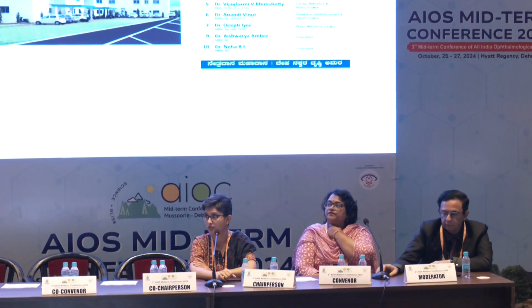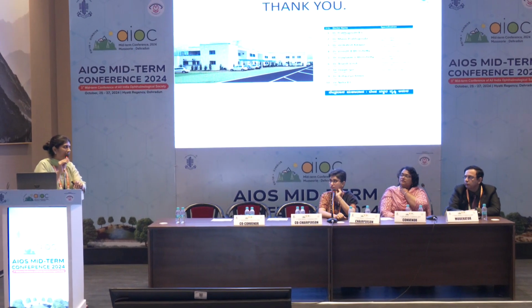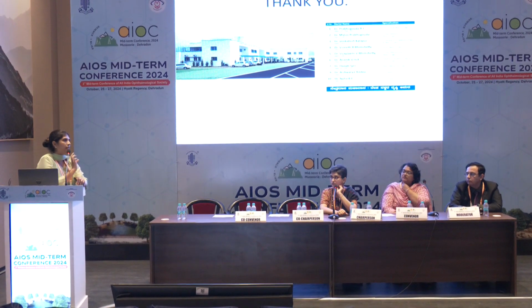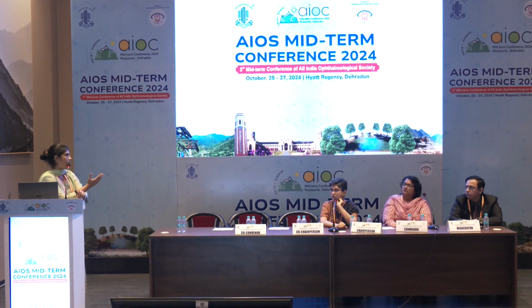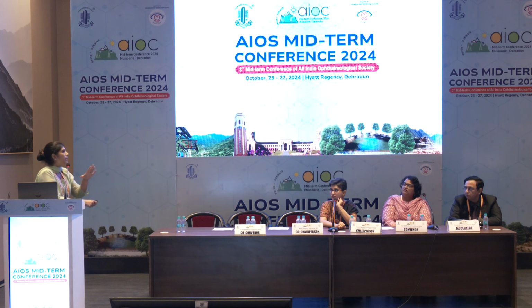What's your experience been on the role in acanthamoeba keratitis? I have not actually used it, but I have gone through a few studies which say that when there is uveitis, acanthamoeba and herpes uveitis, the ASOCT structure will give us some clue. There will be those coin-shaped KPs and convexity of the stroma in ASOCT in case of herpes simplex, whereas when it is acanthamoeba uveitis, the convexity of the stroma won't be there, and the KPs are very small. They're not the typical coin-shaped KPs. That was the only one I could find, but I have not used it routinely.